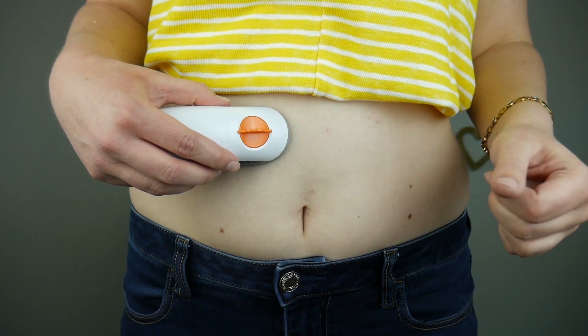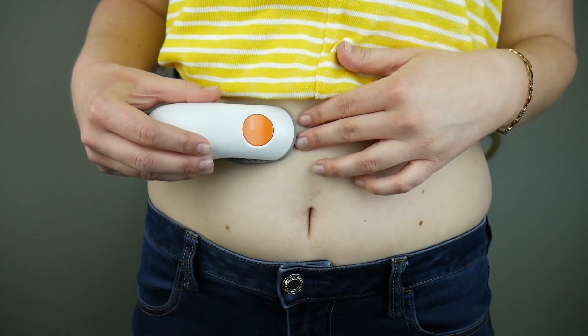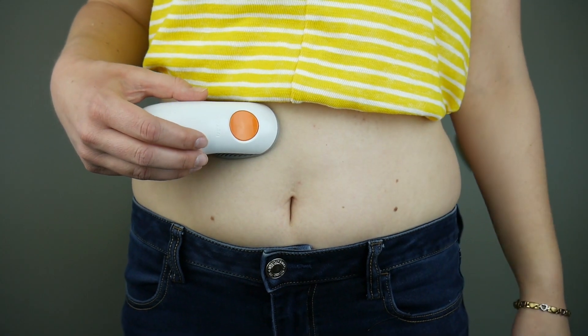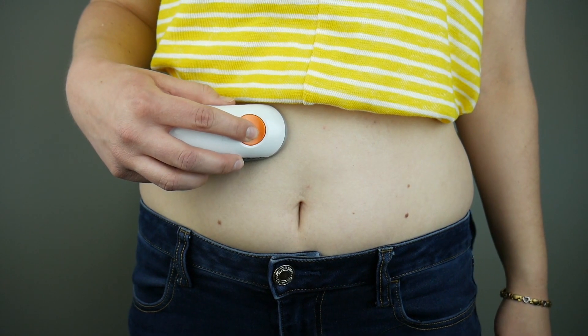I'm going to break off the safety latch just by folding it over like that. So now it's all stuck down and I'm ready to insert it. The way you insert it is just an easy one-button push — one, two, three.